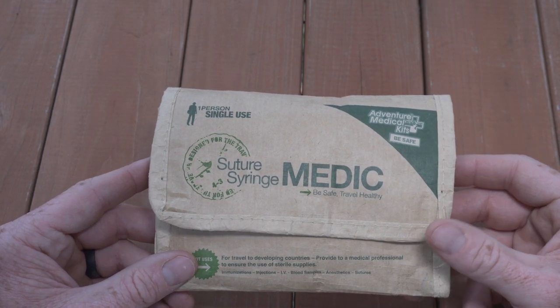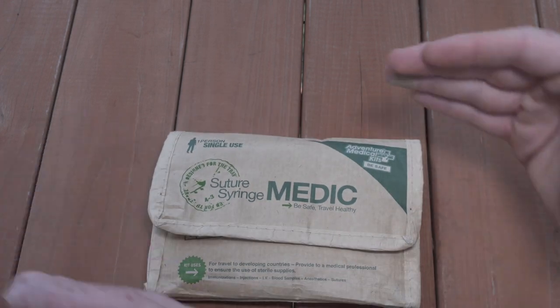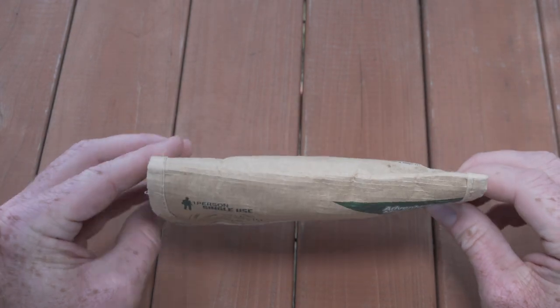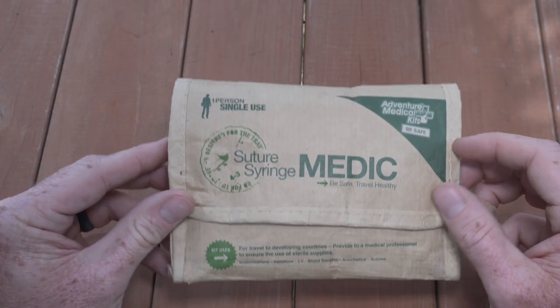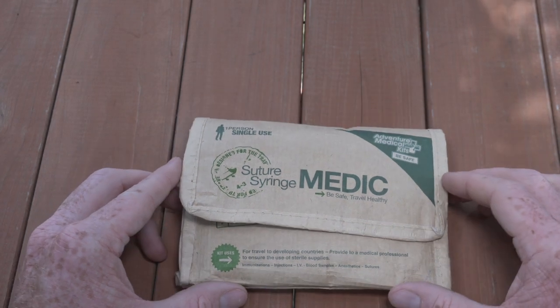It only weighs three ounces and it packs up really small. It's about six and a half inches long, four and a quarter inches tall, and about one inch thick. In terms of size and weight, it's super easy to carry with you and really eliminates any of the reasons why you wouldn't have it.